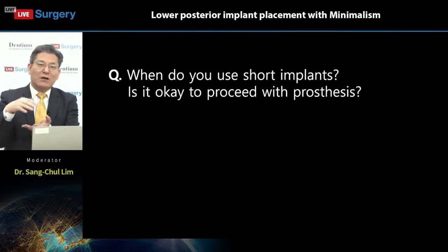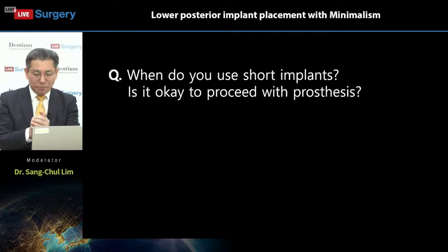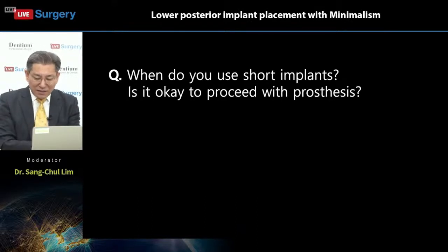Actually, nowadays, implants under 7 millimeters are categorized as short implants. Anyway, a short implant needs a proper crown implant ratio, so we have to consider this, right?